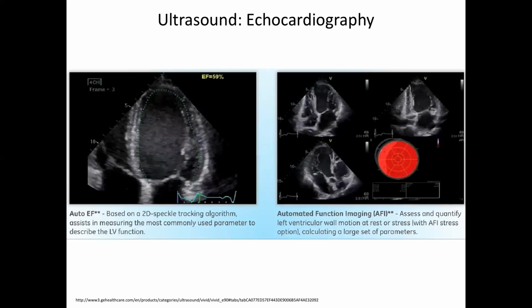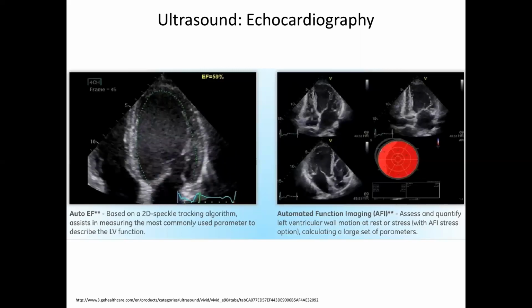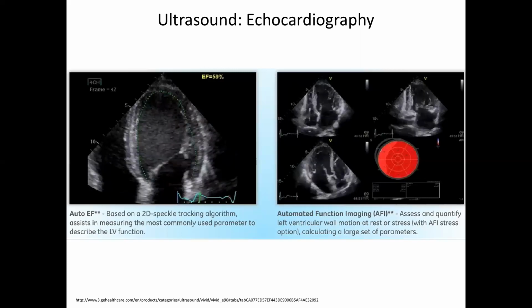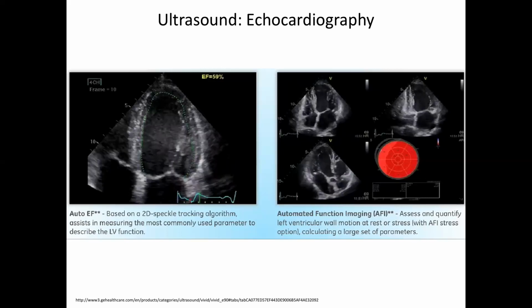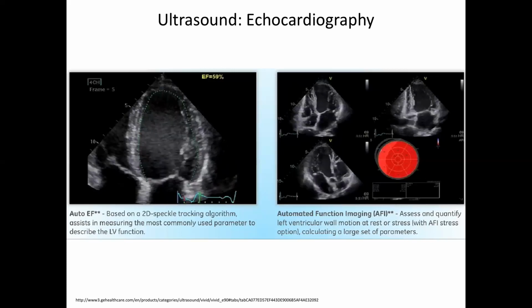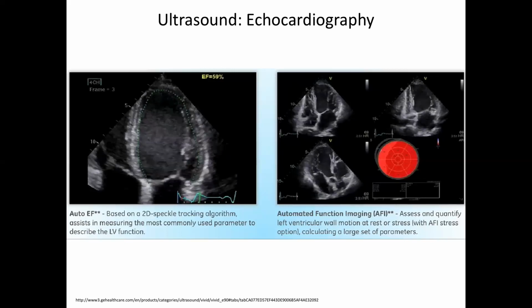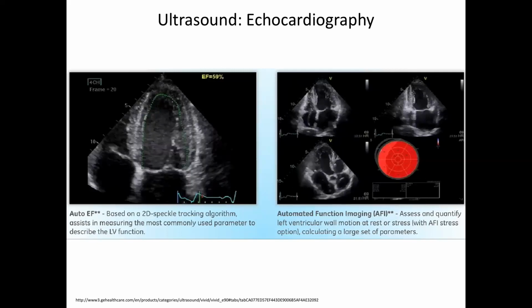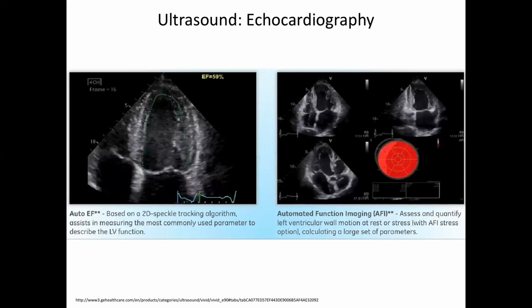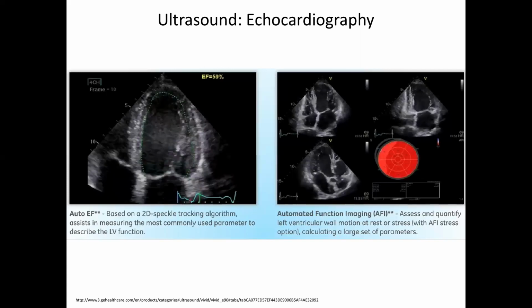I trust more a cardiologist looking at the movie and telling me what the ejection fraction is just from their head than I do somebody drawing the contours. I know that sounds ridiculous, right? But they're really good at it. They look at it and say, this heart is a 30% EF heart. It's almost like they themselves have like a 20-point scale that they can nail. Like they don't bother about anything above 50% because it's all normal. If it's below 20%, you just know that's really, it's in that sweet spot around whether or not they're transitioning, right? And they're very good at it. So I trust the human reads. I don't trust the auto reads.